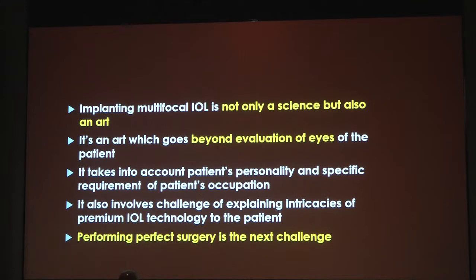After considering all these pre-operative things, then comes the most important thing, performing the surgery, which is the next challenge. And if you are doing SICS and want to implant a premium IOL, it is really challenging. Whenever we attend conferences and see prolific surgeons showing some gymnastics, it is not that they are doing it that way in every case in day-to-day life.